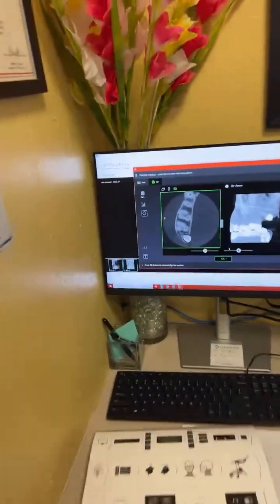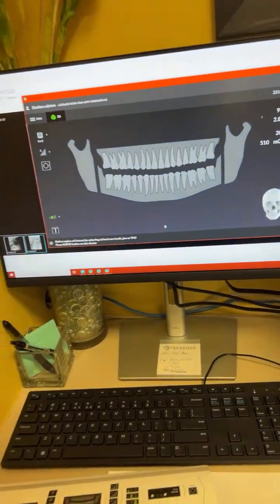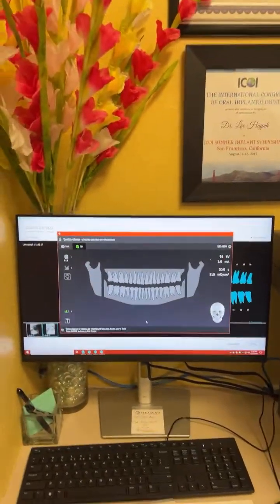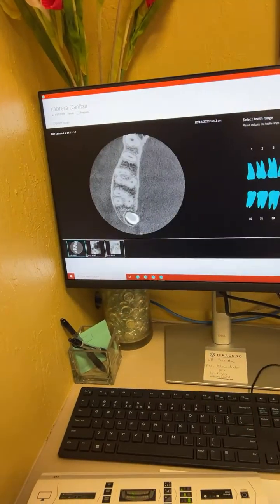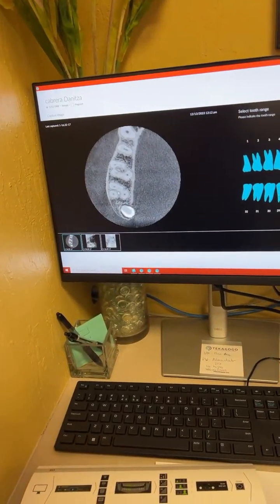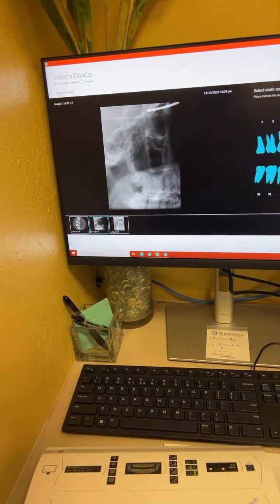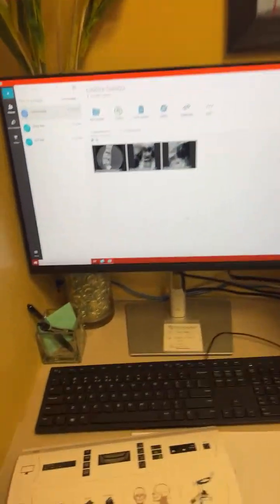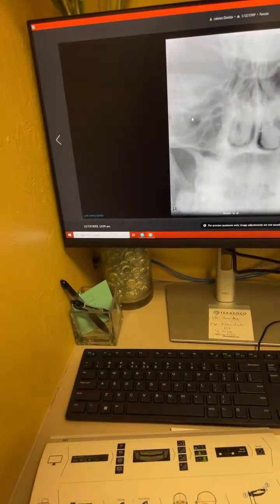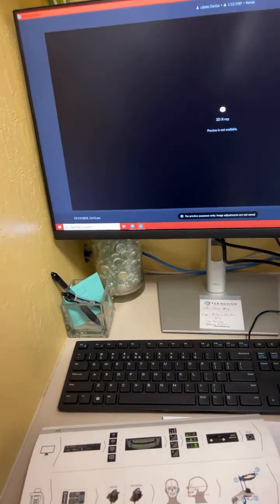Wow. Look at this. Now I want you to hit OK. Just hit OK. All right. Now click on the image behind that screen. Okay. And what you can do now is just hit finish to the right. Just hit finish. And now the AI is going to hit it if there's anything for it to do. In this case, you don't have the IA canal. That's just a scout. So what do we do? Just close out here.